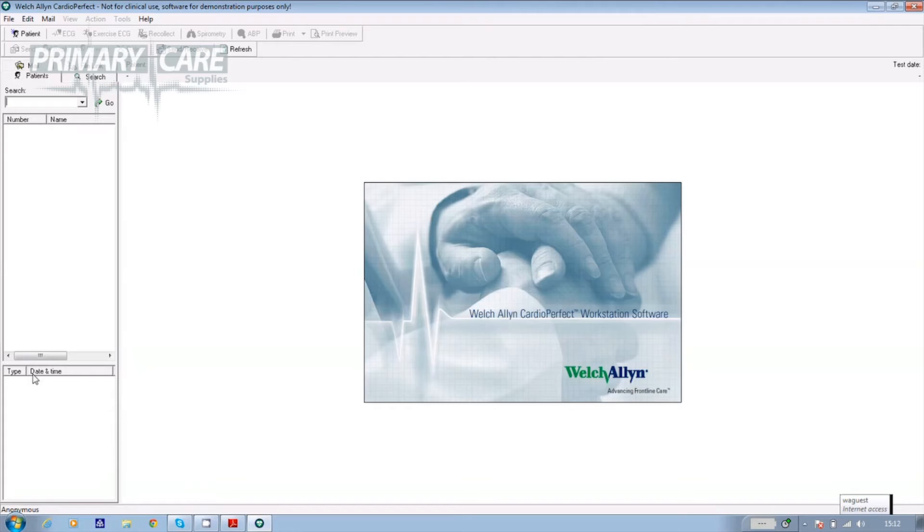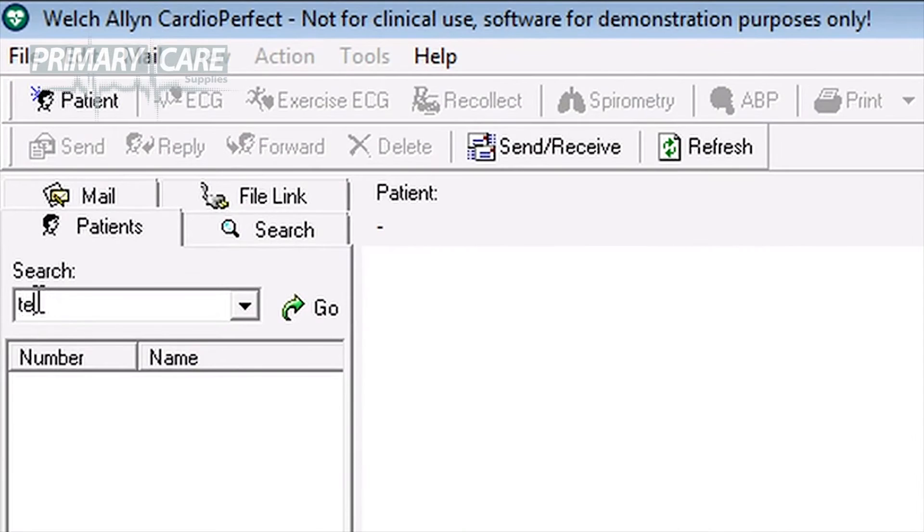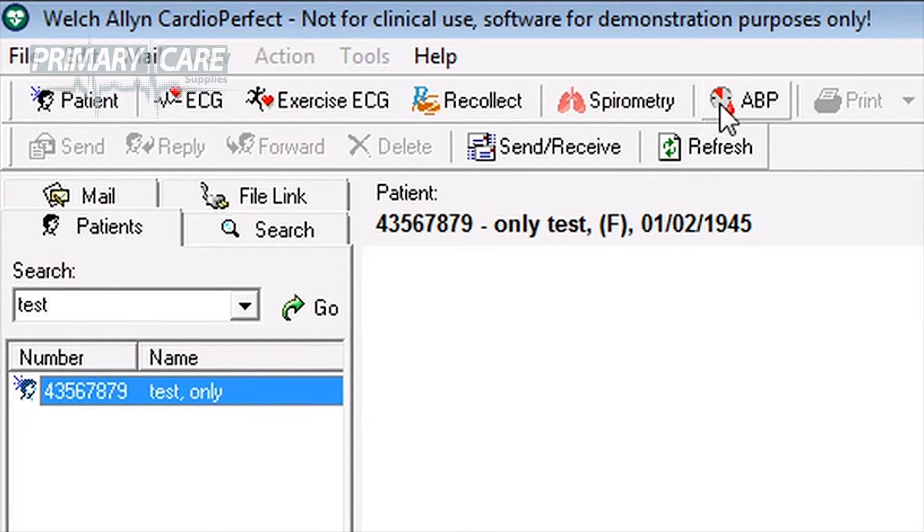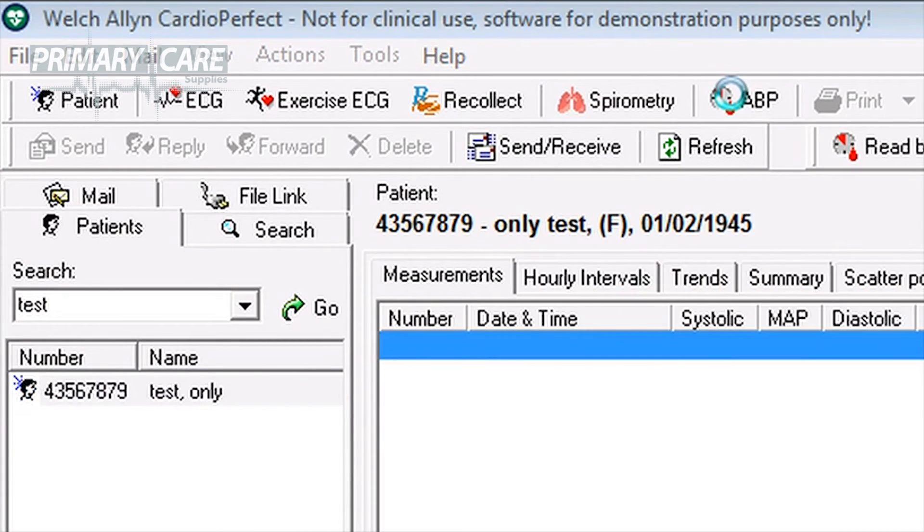If the patient has had an ABP test before, go into the Welsh Allen software and using Search, input either their surname or NHS ID number. Click Go and their details will appear in the database. Having highlighted their name, click on the ABP icon at the top of the screen.